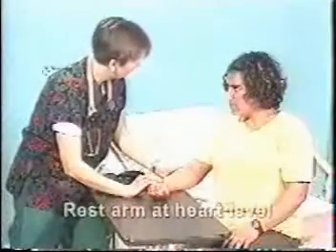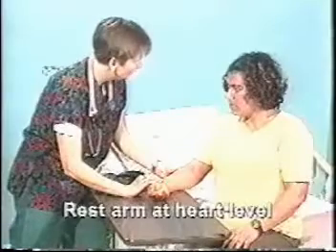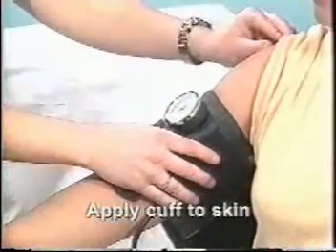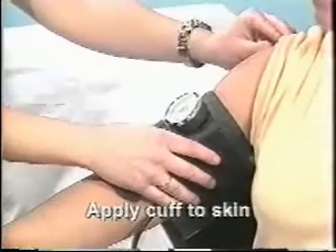The arm should be resting at heart level with the palm facing up. The arm should never be elevated above or below the heart level. The cuff needs to be applied directly to the skin. If possible, to roll the sleeve up, that's perfectly fine. But if it becomes too tight by having it moved up and is constricting the upper arm, or if you simply cannot have the cuff applied directly to the skin in that instance, then you would ask the individual or assist the individual to take that outer garment off.